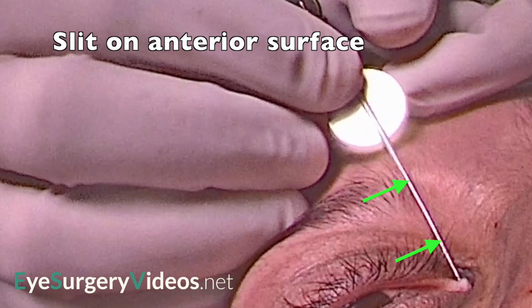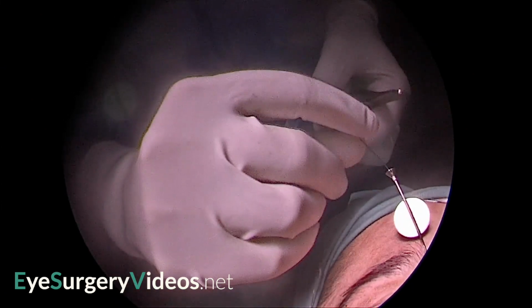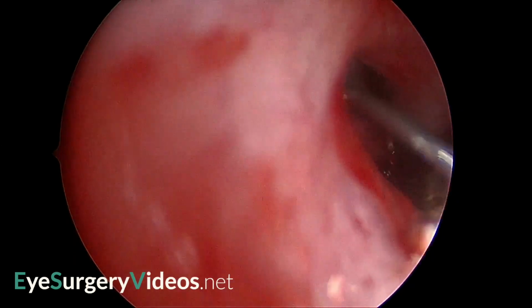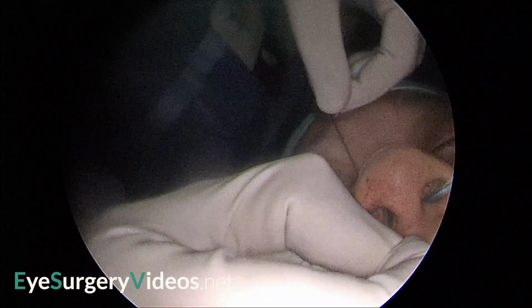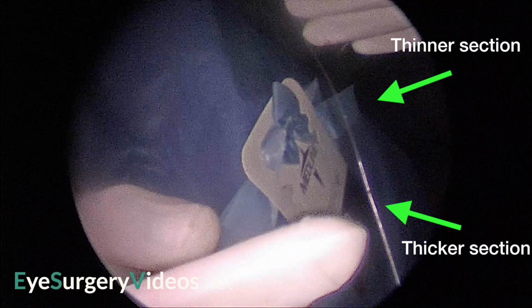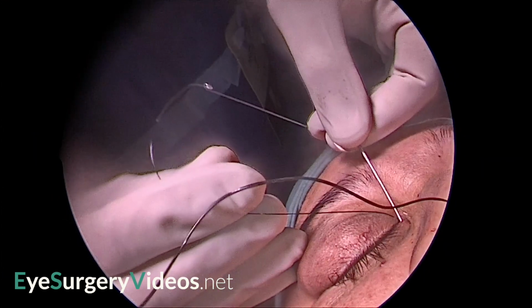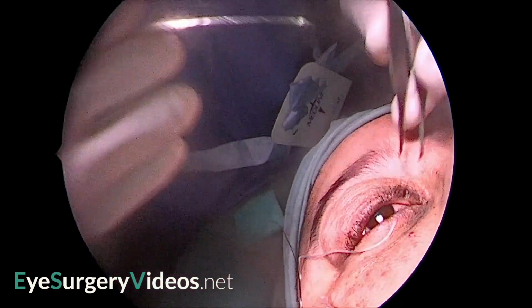The wire section of the Ritleng stent is inserted through the lumen of the introducer. The wire is identified in the inferior meatus and retrieved using the Ritleng hook or a small muscle hook. While the stent can be retrieved without direct visualization, or often just emerges from the nares if it continues to be advanced, the endoscopic view allows confirmation that the stent is passing out of the natural opening of the nasolacrimal duct.